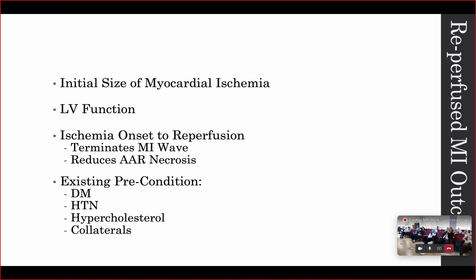We have published a paper comparing different sequences of edema in acute myocardial infarctions. Patients with diabetes and hypertension showed the largest infarct size and the worst LV functions.